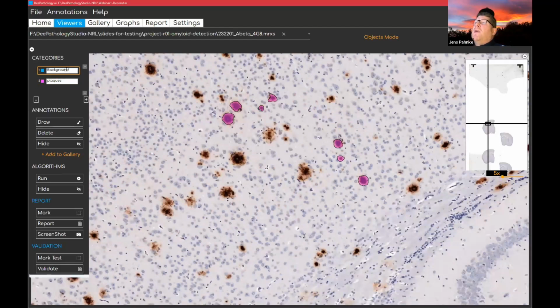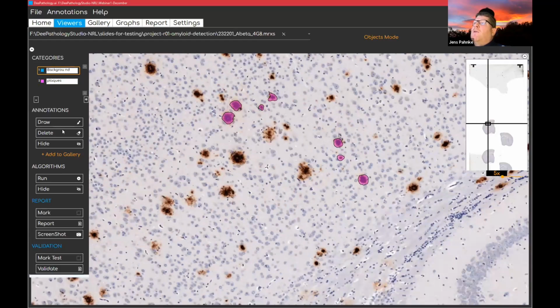And then, of course, I need to have some background because the machine needs to know the background. So I go here. I draw some background here. This is background. This is background. And perhaps this is background here. Or then I have some background here as well. This is background, so that the machine can learn what I'm actually not interested in.